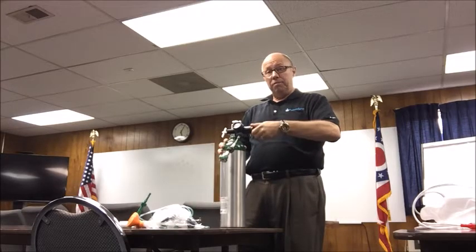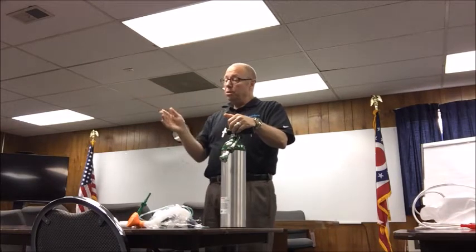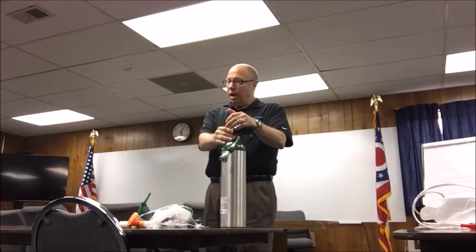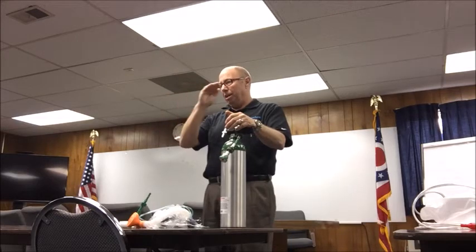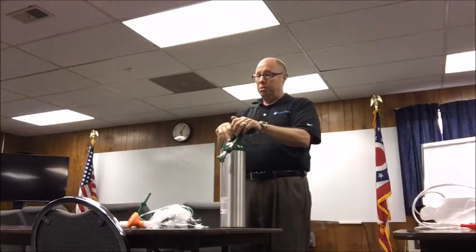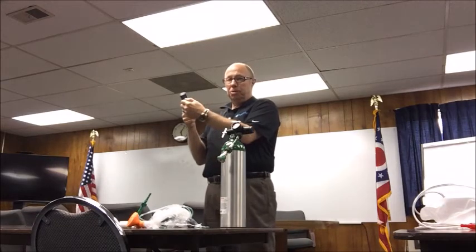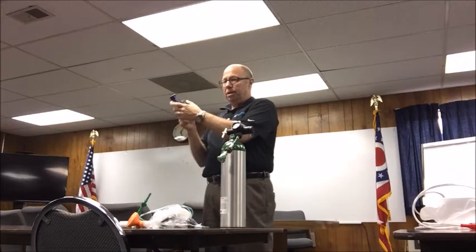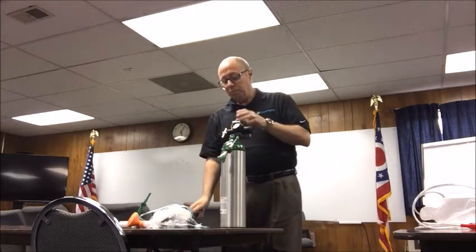We continue to have to turn that flow up to maintain that adequate peak pressure, and those changes in peak pressure affect the work of breathing. On the high pressure side, we can have 2,200 pounds in the tank or about 300 pounds in the tank, and we're going to get that same consistent flow. So that's why we use the high pressure side. And in a regulator in the back of an ambulance, unscrewing the Christmas tree and screwing the circuit into that is not on the high pressure side. The high pressure side is the 50 psi port. So that's why we use it.